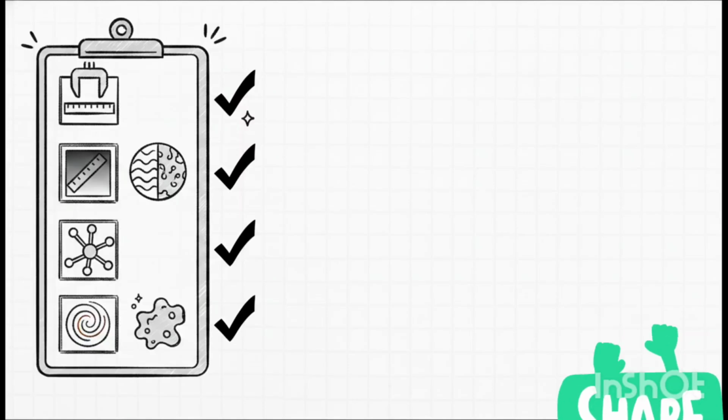Number 1, size. Number 2, echogenicity. Is it bright from fat? Number 3, echotexture. Is it smooth or is it rough and coarse from cirrhosis? Number 4, vascular structures. Always track those portal and hepatic veins. Number 5, focal lesions. Scan carefully for any cysts or tumors. And number 6, color Doppler blood flow. So the crucial point is to memorize this exact sequence. Run through it every single time you pick up the probe, and you won't miss a critical finding.